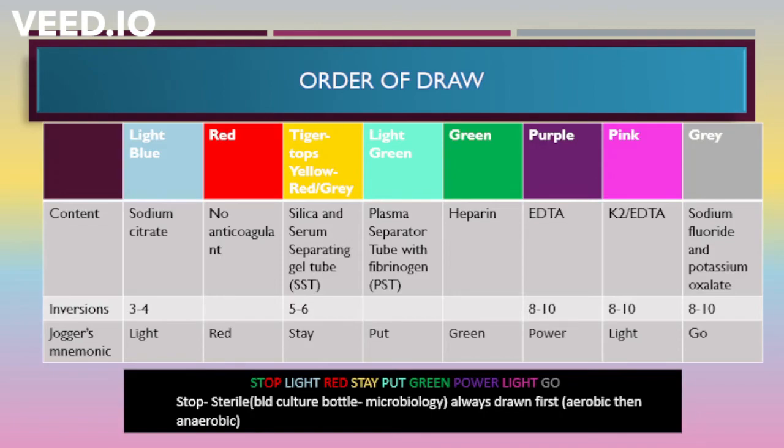Here you can see in the table I have also added the number of times you need to invert the tubes once the sample has been taken. Please make sure not to shake the tubes, as that might cause hemolysis. So this is it about the order of draw.